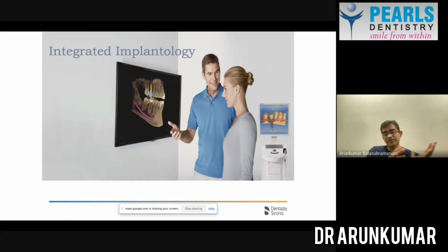So this is what integrated implantology is. All this while, in the previous photograph that I showed, the patient had their natural teeth, and we were able to give a crown or design a smile on the natural teeth. When the patient loses their natural teeth, we need to do an implant, and once we do an implant, we need to give a tooth on top. So that was the earliest photograph which I showed about the surgical goal, the prosthetic goal, and then the aesthetic goal, right? If you remember, that was the earliest photograph. So this is what we do using integrated implantology.